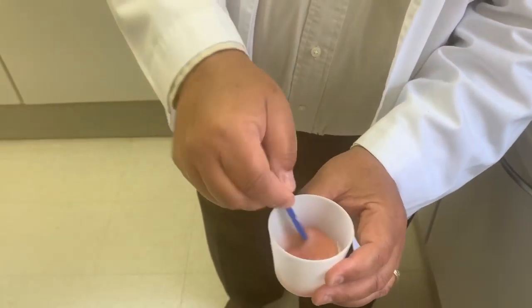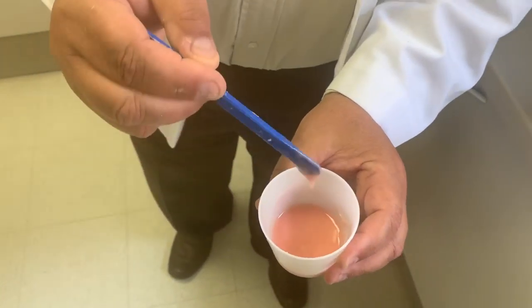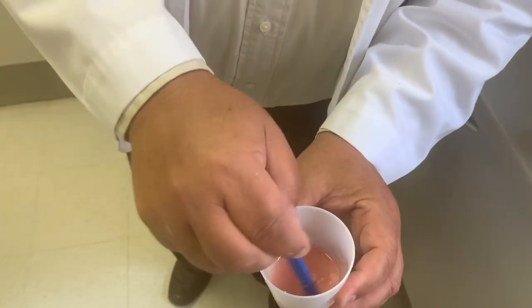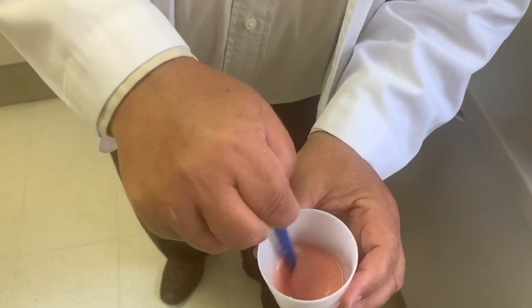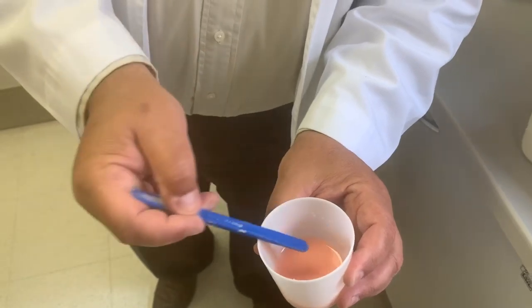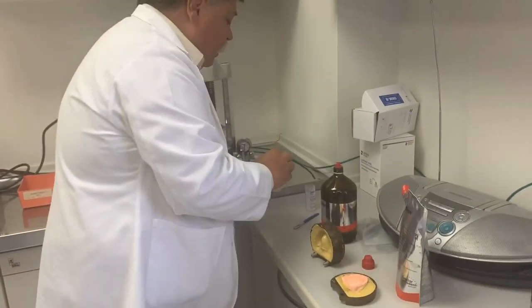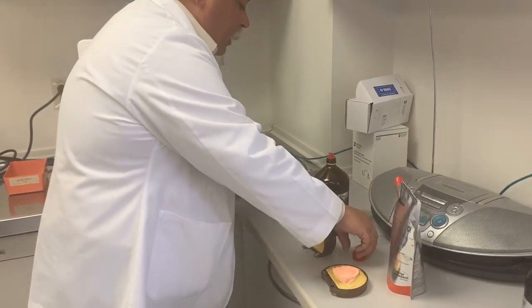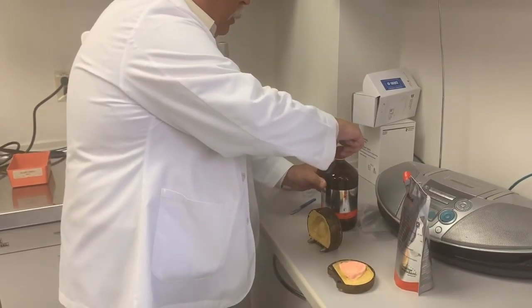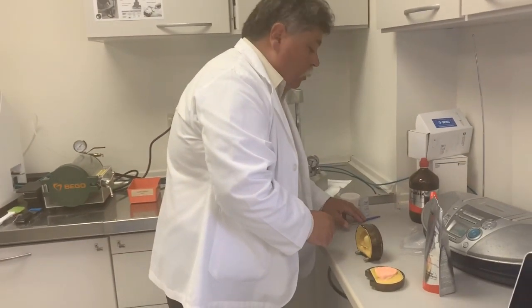It's a soupy mix at this point, like a smoothie. In a few minutes, this will begin to harden, and we need it to get into a doughy state. So we're going to cover this up and let it sit for a few minutes. We'll come back to it and we'll be able to pack our denture.